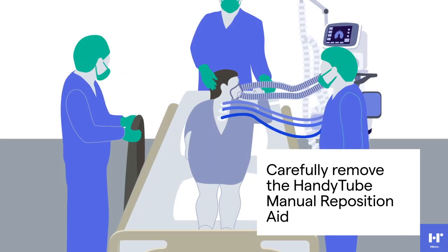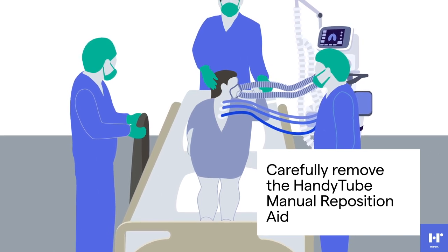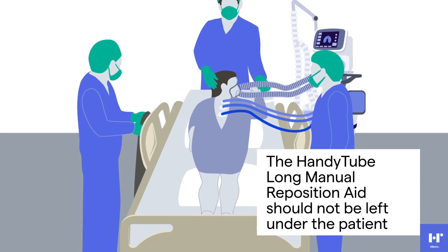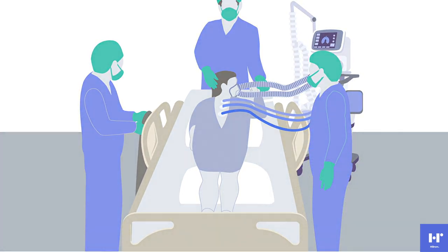Carefully remove the handy tube by pulling the fabric from underneath the patient until it completely releases. Please note, the Handy Tube Long Manual Reposition Aid is not made of breathable fabric and should not be left under the patient.